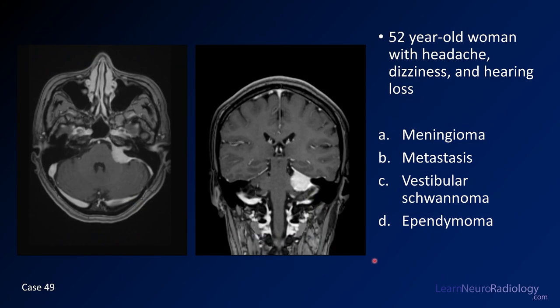Case number 49 is a 52-year-old woman with headache, dizziness, and hearing loss. Two post-contrast images — axial and coronal. Your choices are meningioma, metastatic disease, vestibular schwannoma, or ependymoma.